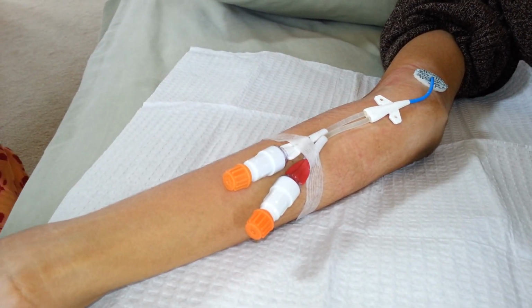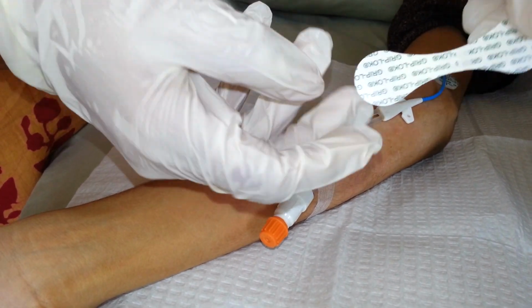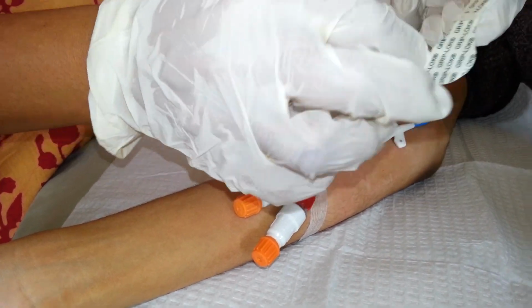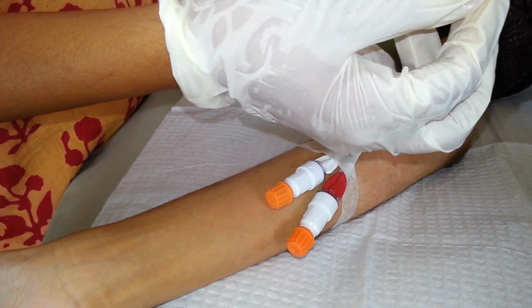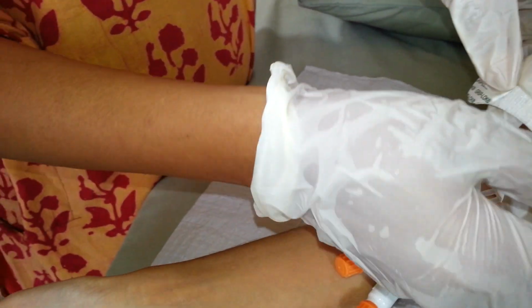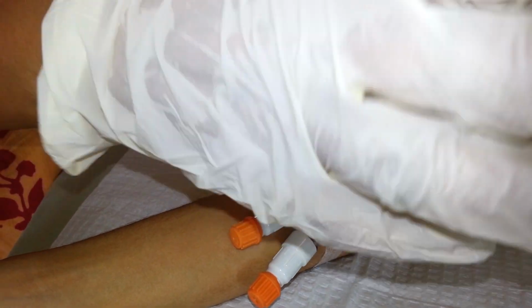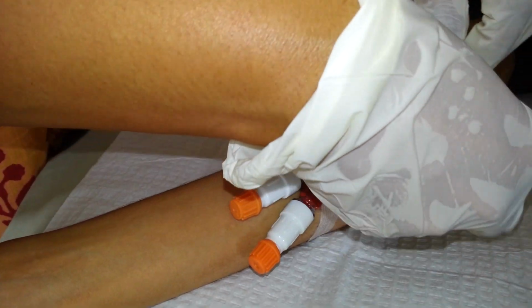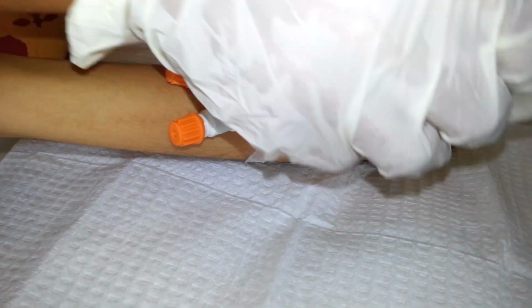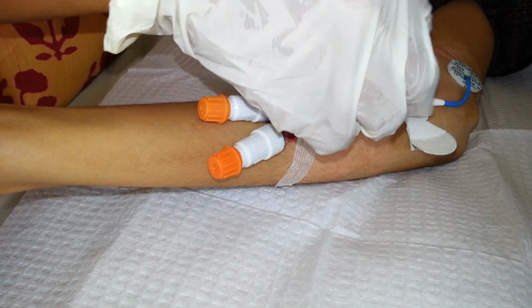Now we will secure the catheter using a Griplok. It looks like a little wing where the hub of the catheter fits in, and then we close the wing. We will remove the cover from the Griplok, slide it under the hub, stick it on the skin and put the hub in the wing.